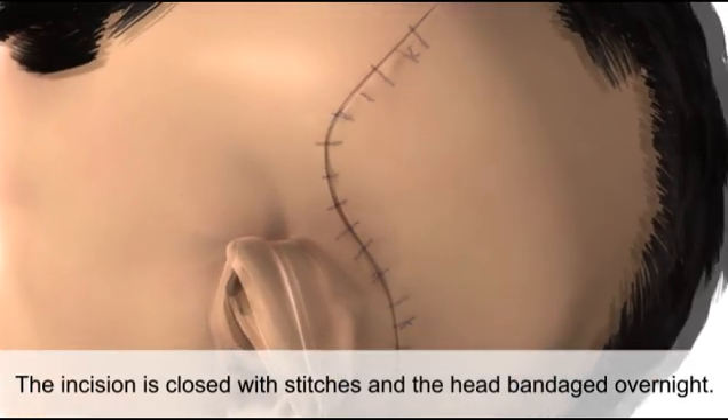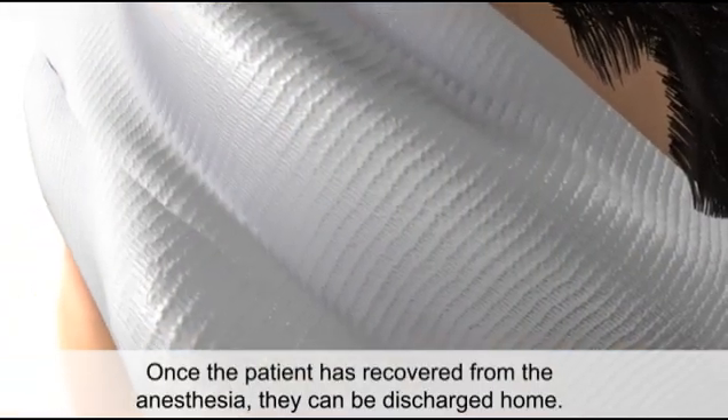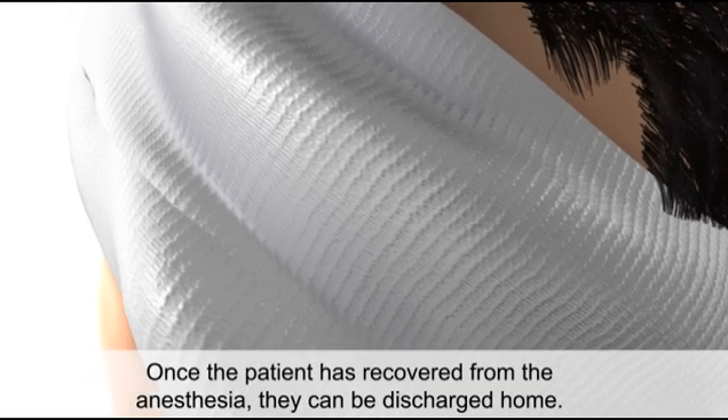The incision is closed with stitches and the head bandaged overnight. Once the patient has recovered from anesthesia, they can be discharged home.